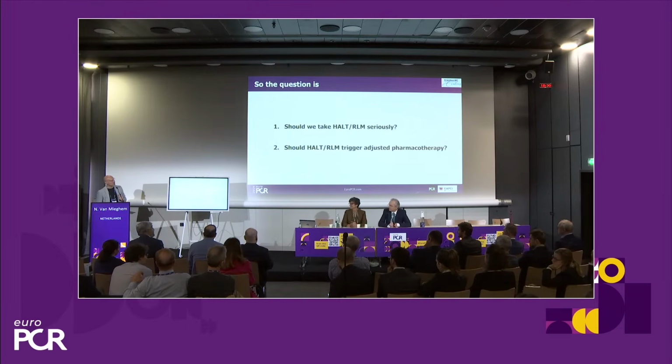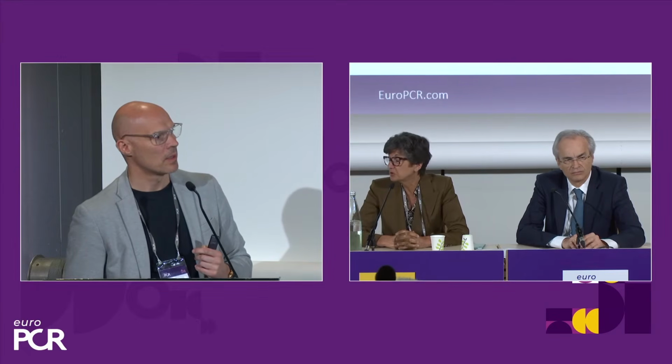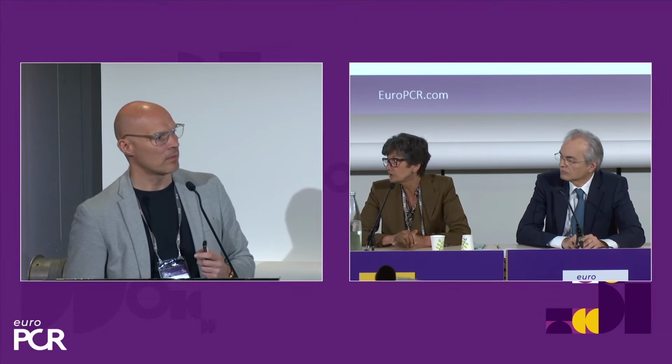Okay, Joël, do you have any protocol in place in your center, or is it more or less the same as what we were describing? It is more or less the same. So the follow-up is clinical and echocardiographic. And in case of clinical problems, we do a CT, but we don't do a routine CT scan follow-up in the clinical practice, only in the situation of clinical research.